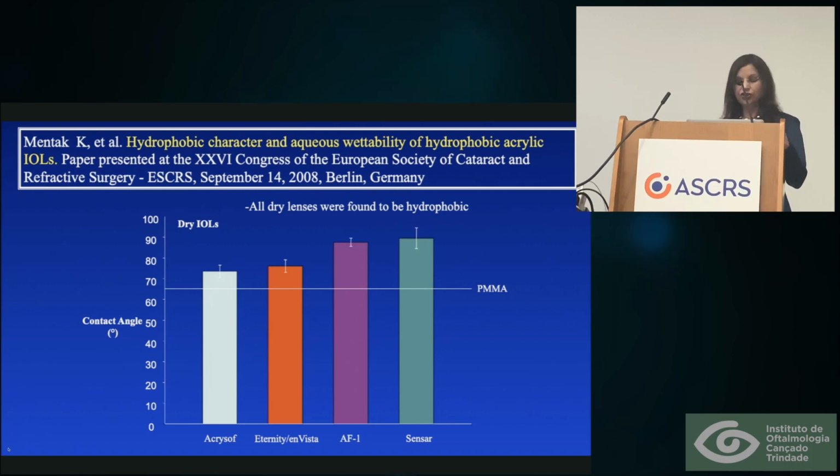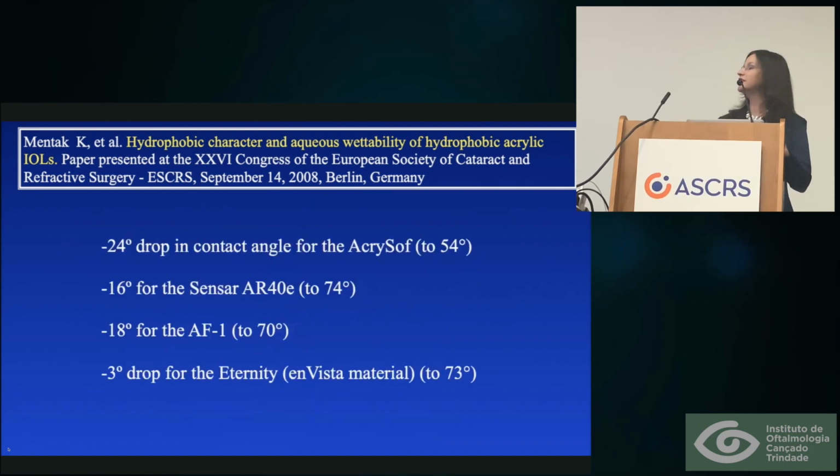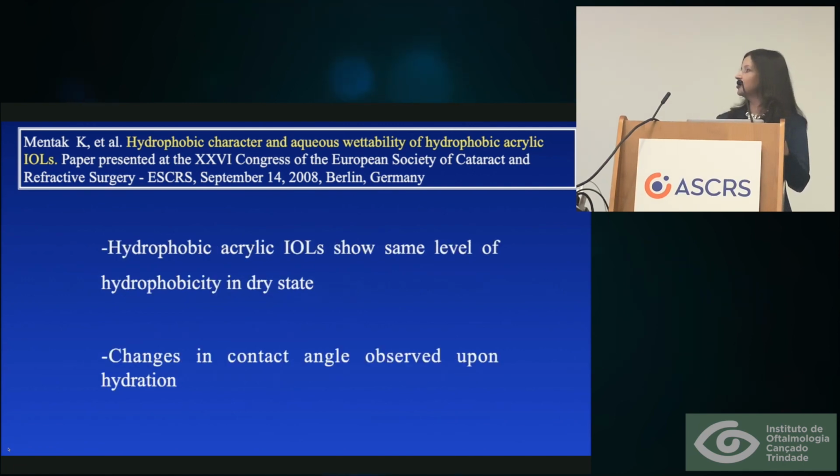However, after hydration at different time points, there is a change in this property towards hydrophilicity, so the materials become less hydrophobic. So in his conclusion, he mentioned that hydrophobic acrylic IOLs all showed a similar level of hydrophobicity in the dry state, but there is a change towards hydrophilicity after implantation, after hydration at body temperature.